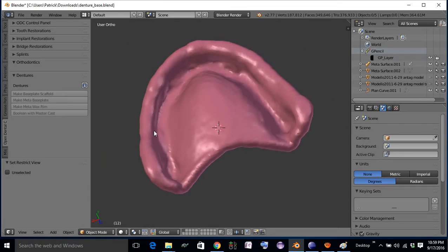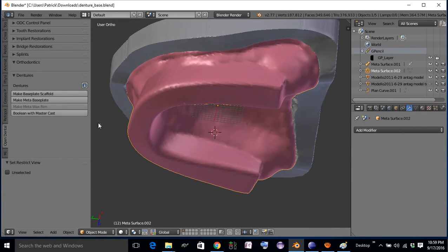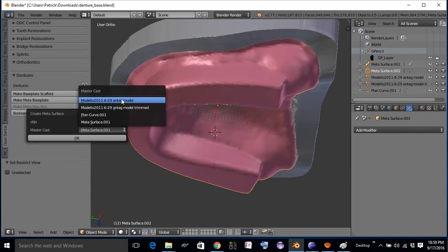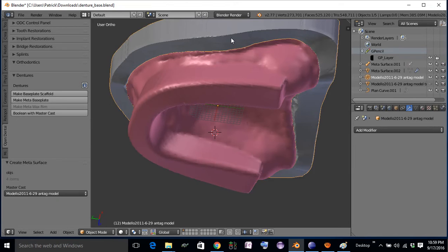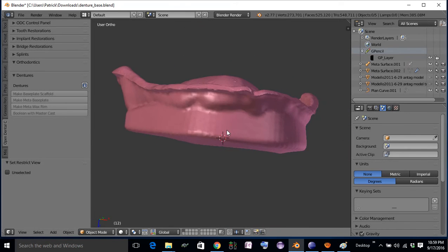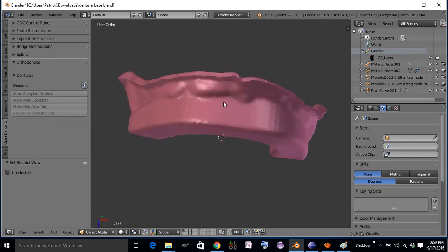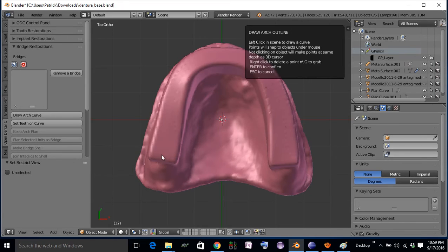Once you've done that, select this object and you'll see Convert Meta Base Plate to Mesh. The final step is that this blobby interior surface needs to recapture the master model detail. So you hit Boolean with MasterCast and select the MasterCast model. Now you have full detail on the inside and a nice starting point to sculpt your gingival detail in.